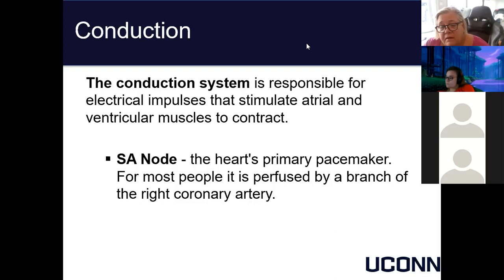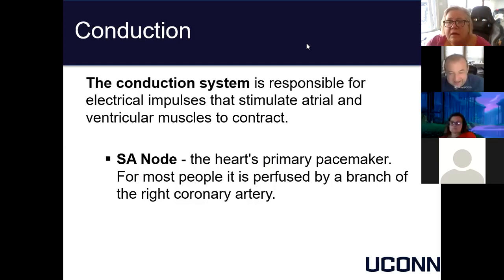Okay, so because you know that the P wave is atrial depolarization, you know that right after that is the atrial systole, but you just know that because the atrial excitation happened. It's not necessarily shown on the EKG. Correct. If I can say, Robin, that's hard to imagine, because it shows the electrical activity in the muscle in the atria and ventricles. It's hard to imagine that the whole thickness of the wall is electrically active but not moving.